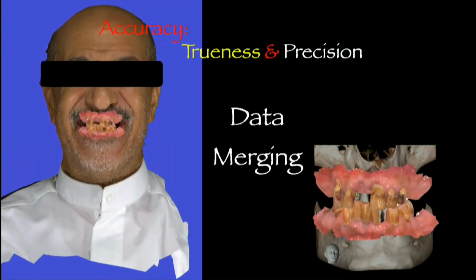Common information between both files is very important, so we can have information merged together very accurately. Now, the problem is that the common information between intraoral scanner and facial scanner is not much at all. In the facial scanner, we have teeth, and in intraoral scanner, we have teeth, which is considered common information. However, the problem is that facial scanners distort teeth to a certain extent. It makes that merging process really inaccurate. And this is where I believe artificial intelligence can be of good help in identifying similar patterns, but I think no commercially available scanner or software is available to do that yet.